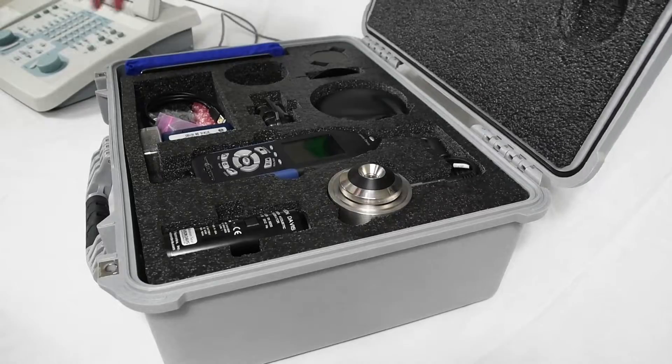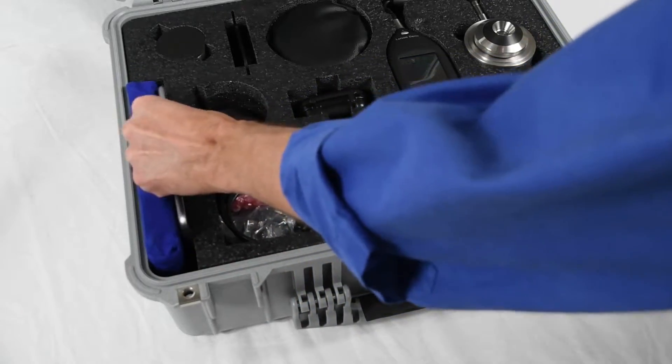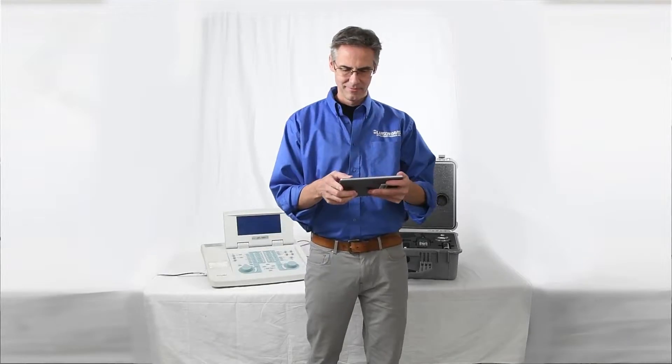The OddCal from Larson Davis is a portable testing system to aid in audiometer calibration. In this video, we will walk you through the included equipment for the Sys17 model.